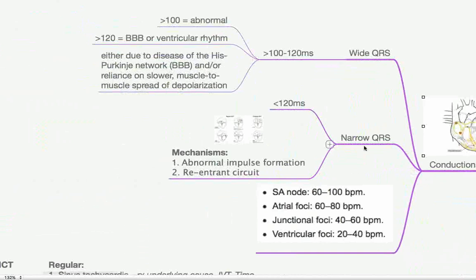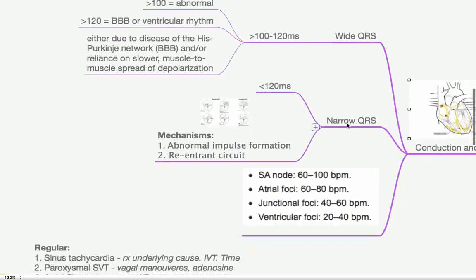So what is a narrow complex? Basically, anything regarding the QRS complex above 100 milliseconds is pretty much abnormal. Above 120 milliseconds is definitely abnormal. Those are three small squares. It could be a bundle branch block or a ventricular rhythm. And we're not really interested in that today. We're looking at narrow QRS. So it's certainly below 120 milliseconds. Just remember that number.